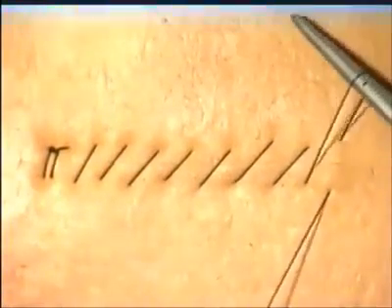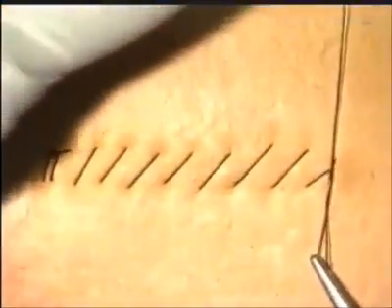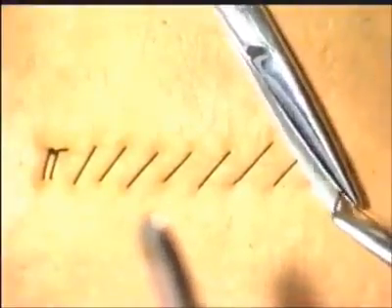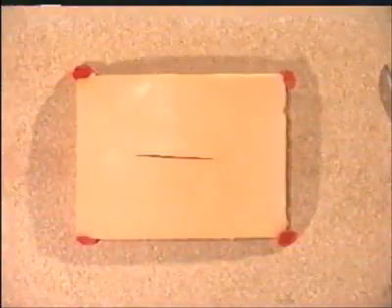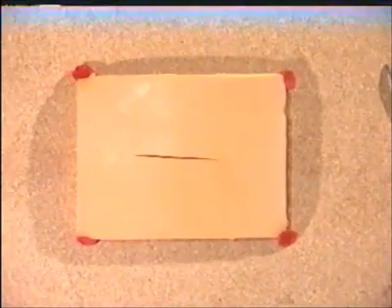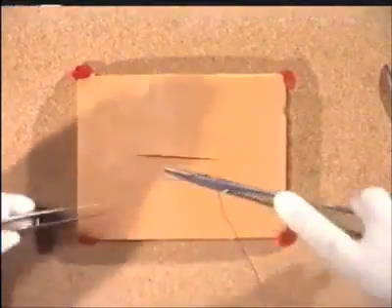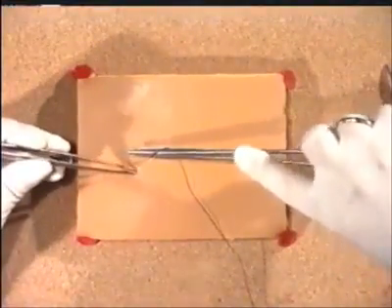After the final suture has been inserted, leave one loop long, and then ligate using a standard reef knot technique. Once this has been tied, you are in a position to cut both ends of the suture material. We will now demonstrate the essential role of the assistant in the insertion of a continuous suture. Start once again by inserting the initial suture, and ligating this using the reef knot technique.